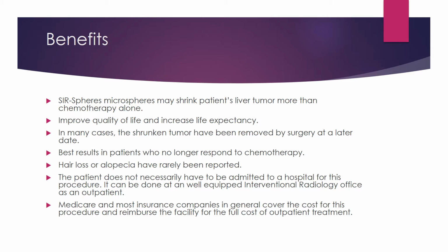Hair loss or alopecia has been rarely reported. The patient does not necessarily have to be admitted to a hospital for this procedure. It can be done at a well-equipped interventional radiology office as an outpatient. Medicare and most insurance companies in general cover the cost for this procedure and reimburse the facility for the full cost of outpatient treatment.